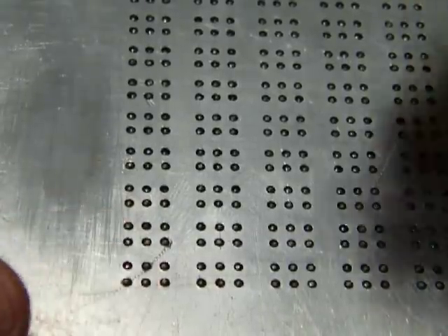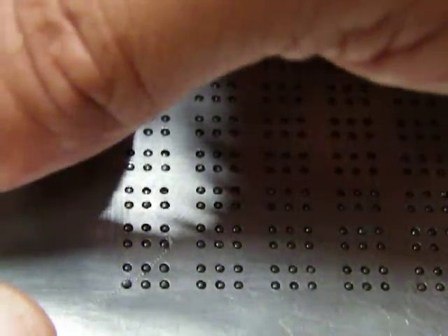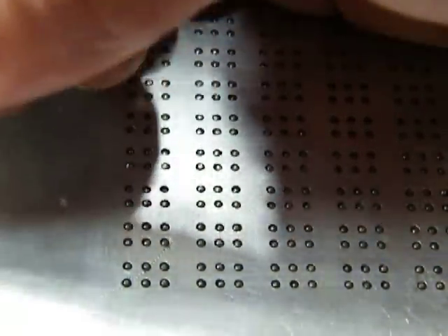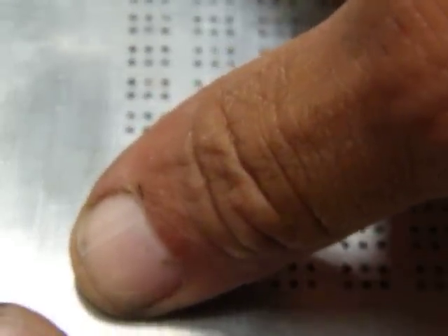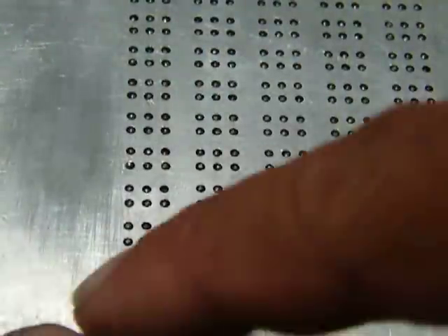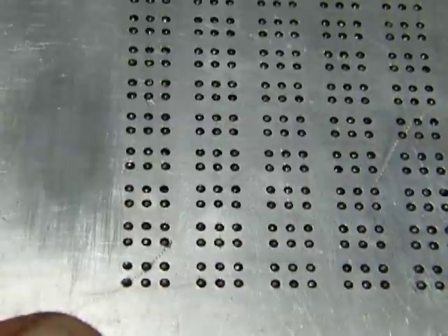Suppose I wanted a, I don't know Braille, so the first dot and the second dot on this cell 1, I would enable one column at a time. So just enable one column, the first column first. I'd set pin 1, dot 1 is set. I'd lock it in position, prepare for the next enabling. Now the column 2, dot 1, enabled, set it, latch it, release. So now I've got 1 and 2 there. So basically a computer control would refresh one column at a time from one end to the other, therefore refreshing the whole page.